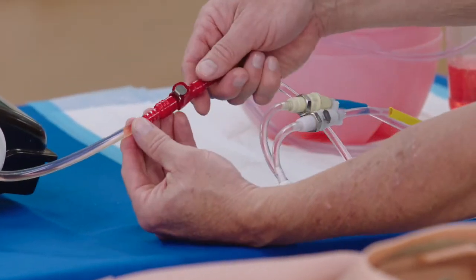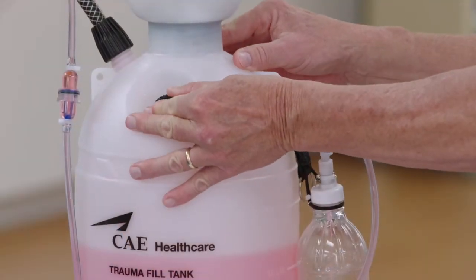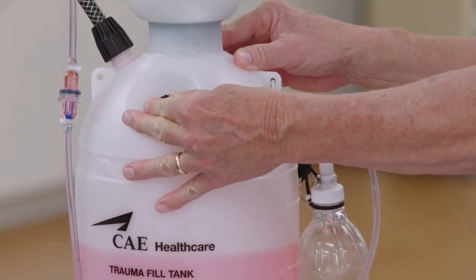Disconnect the trauma fill tank from the blood tank and depressurize by opening the yellow pressure relief knob. The blood tank is ready for use.